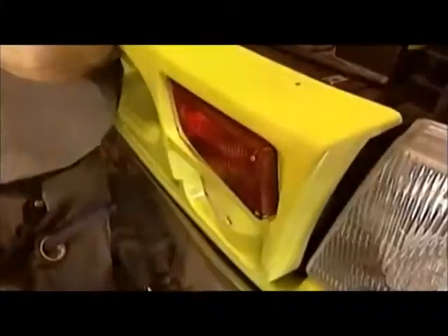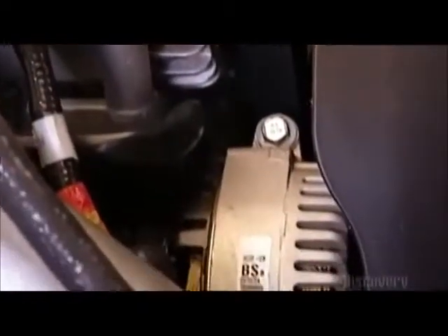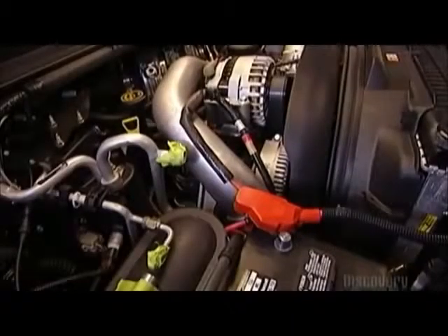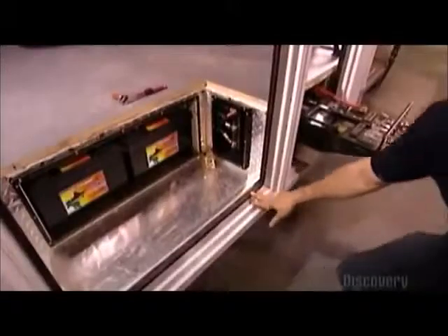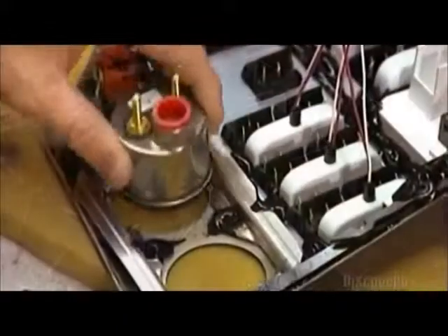They start by replacing the truck's original grille with an ambulance grille that incorporates lights, a siren, and loudspeakers. The truck comes equipped from the automotive plant with certain options designed for conversion to an ambulance. For instance, instead of 2 regular batteries, the truck takes 2 new pairs of batteries, one set to power the truck accessories, the other to power the equipment in the back.